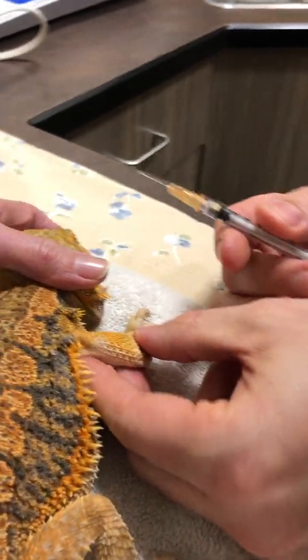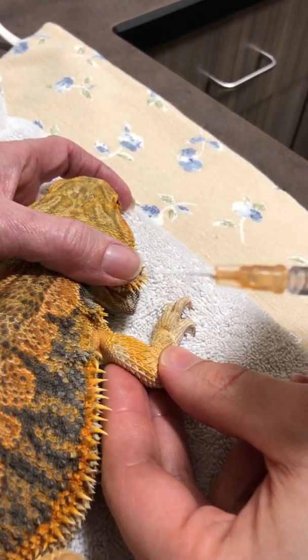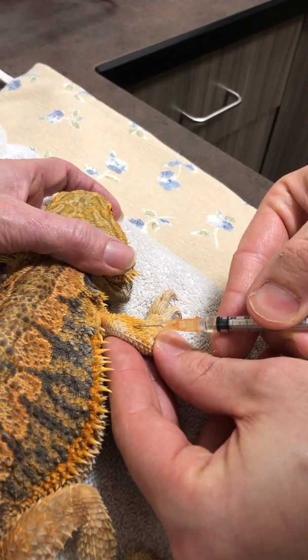When going in, try to keep the needle with the little slant — the bevel — pointed slightly up. Then you're going to go in between the scales.